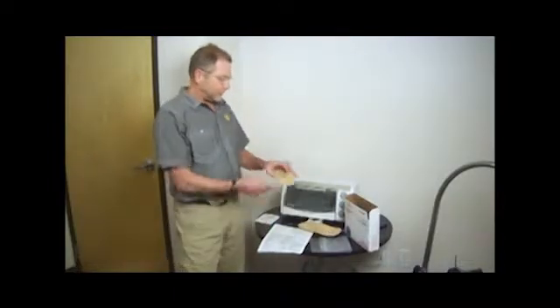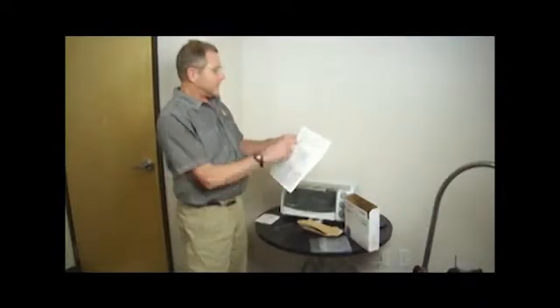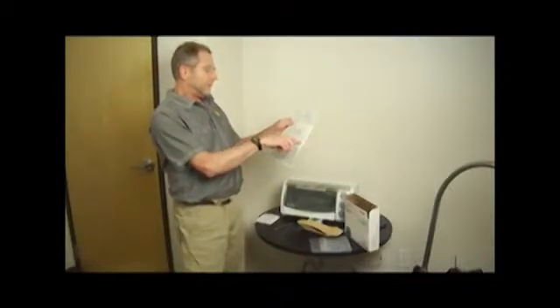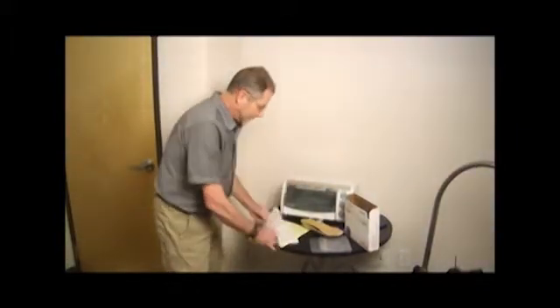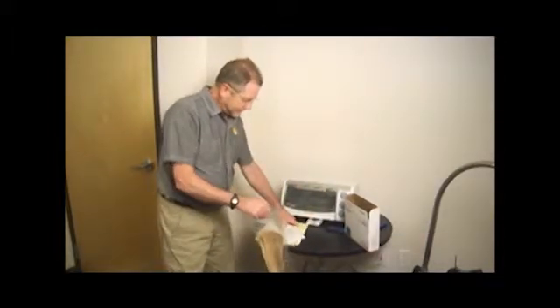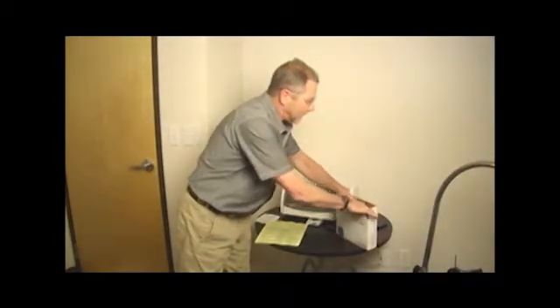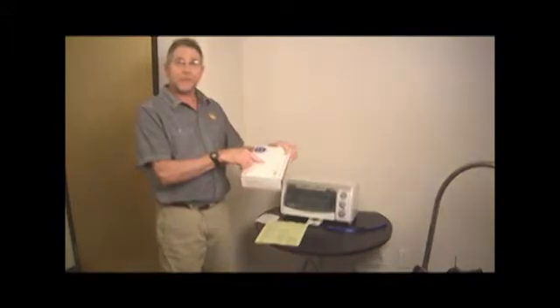Now we have the impression cores properly labeled with the patient name and your facility name. We have the form filled out, your facility, patient name, and information. Here you've selected the shell, whether it's the heel post or arch fill, top cover. You want a little extra forefoot cushioning. You're going to take your copy, file it, take the lab copy. I suggest you reuse the envelope, the mailer bag. Place it in the bag, then into the Priority Mail box, and then seal it up and place your mailing information on the box.